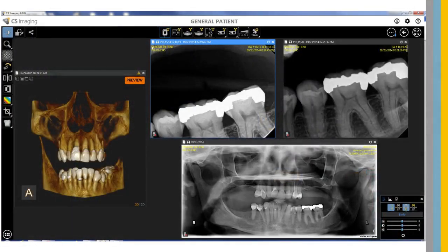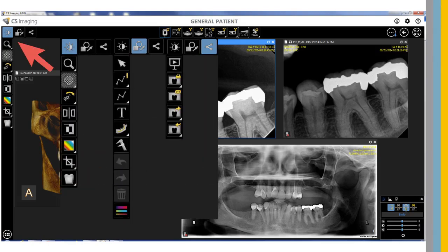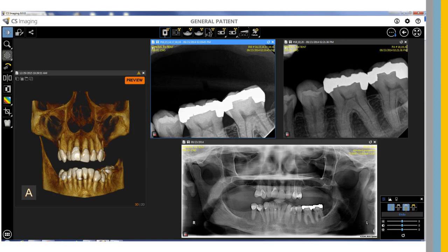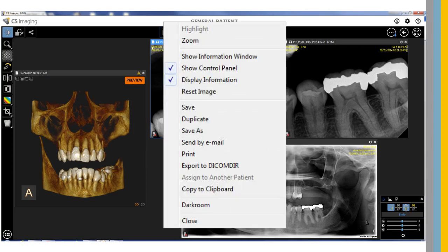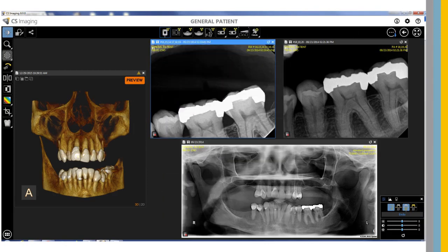CS Imaging Version 8 has a new, modern user interface and the black background enhances the diagnostic experience. Tools are now easier to access and there are additional right-click functions. The invisible image frame provides additional space for review.